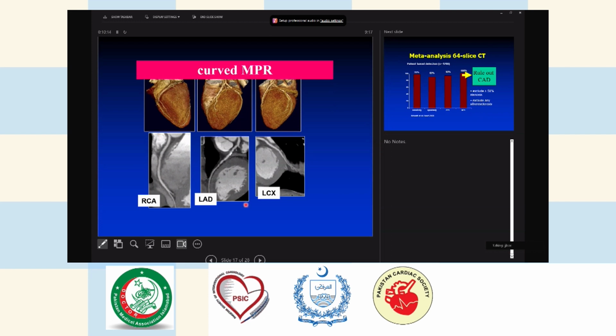We do it more and more in these heart failure patients because they have nowadays very good control with the heart rates, and the CT scanners can move so fast so that we get a non-invasive picture immediately, and we see the coronary arteries where there is some calcium, little bit of stenosis here, but at least we know immediately, are these coronary arteries normal or not? And if they are abnormal, then we can consider doing an angiogram. But in the non-ischemic dilated cardiomyopathies, it's good to see immediately coronary arteries normal. We don't need to do anything else invasively.